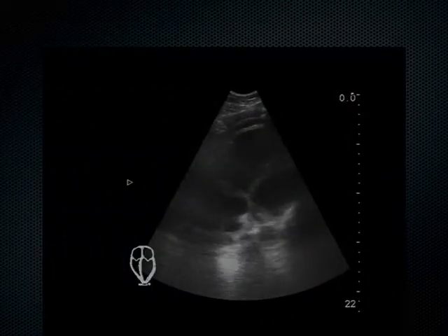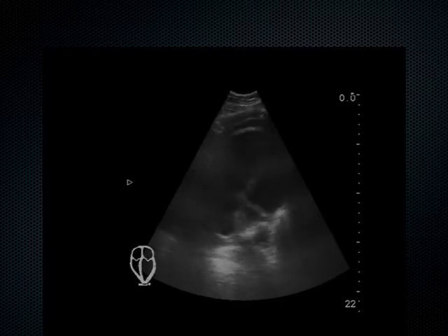This is what it looks like. This was an employee of the hospital who had an external fixation device on his leg, 41-year-old male. He went home after orthopedic surgery. 2 days later, he came back in full-blown cardiac arrest, PEA. We're doing CPR on him, and we saw his heart with no pulse.